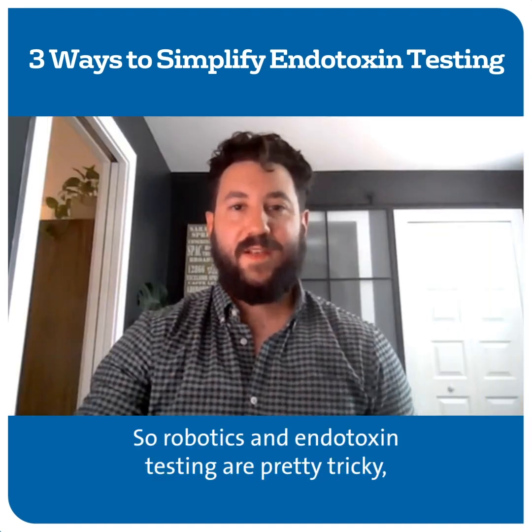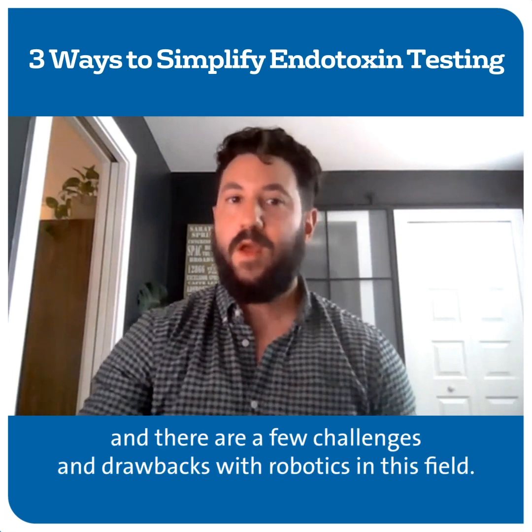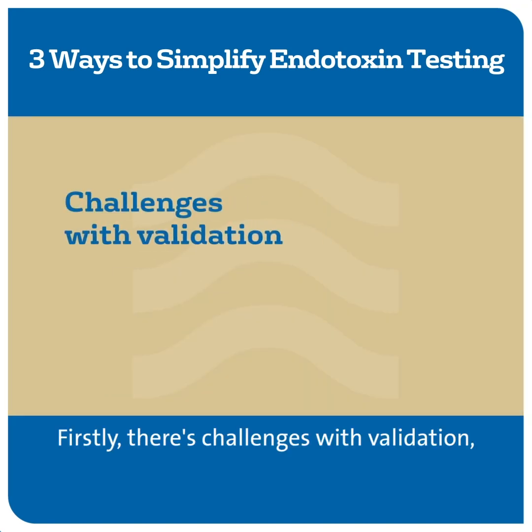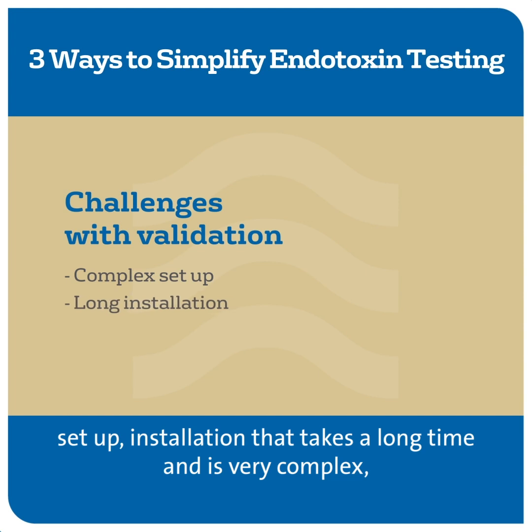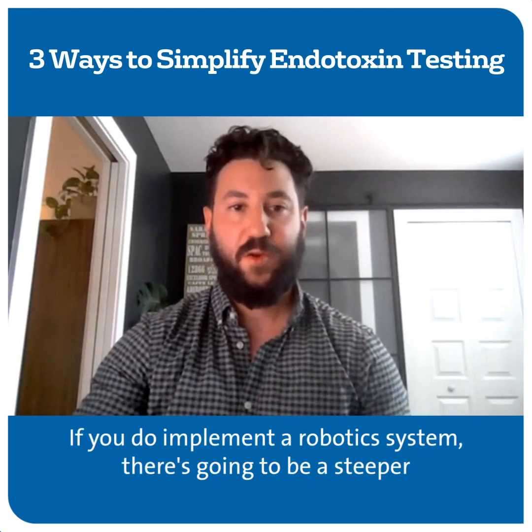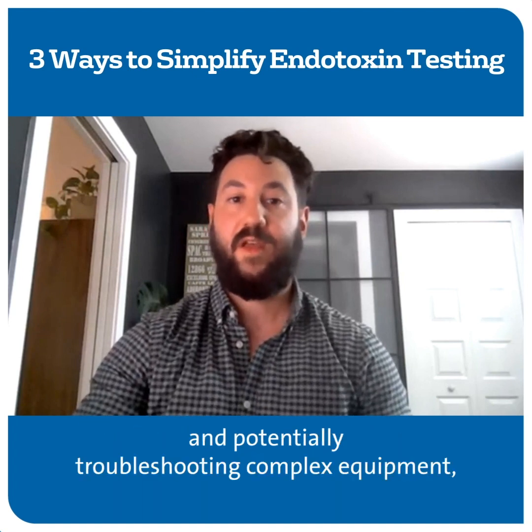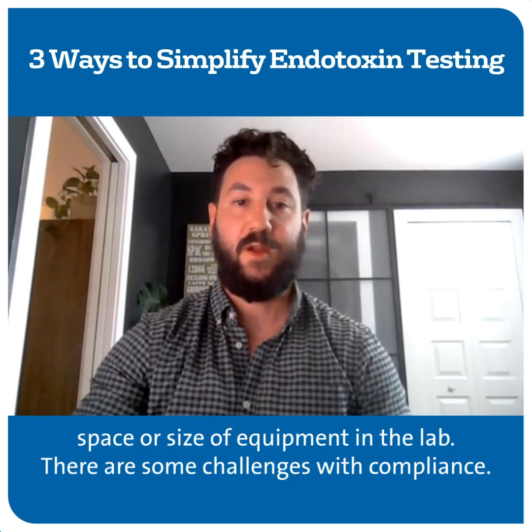Robotics and endotoxin testing are pretty tricky, and there are a few challenges and drawbacks with robotics in this field. Firstly, there are challenges with validation. When they try to validate them, they might have issues with a complex system setup, installation that takes a long time and is very complex, and validating a robotic platform can limit successful implementation. If you do implement a robotic system, there's going to be a steeper learning curve for training and potentially troubleshooting complex equipment, not to mention the space or size of equipment in the lab.